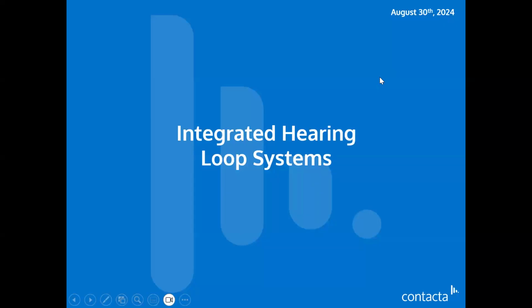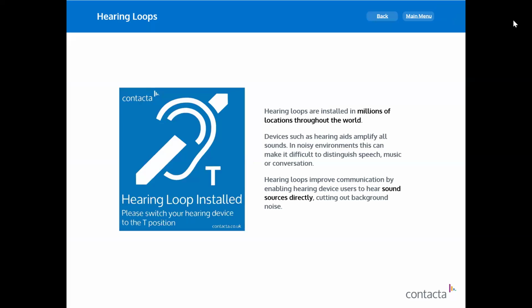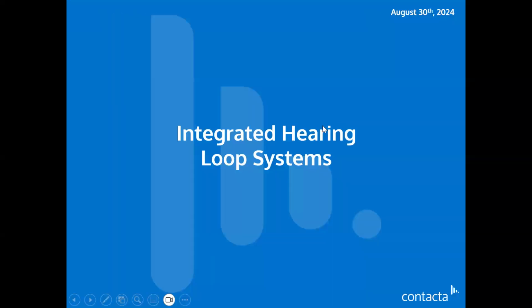In this presentation, we're going to cover integrated hearing loop systems. In our previous webinars, we talked about hearing loop systems. We also covered the vPro drivers, which was a more in-depth webinar. We talked about assistive listening in the first webinar that you may have taken part in. So I'm just going to start very quickly by covering the principles of hearing loops.